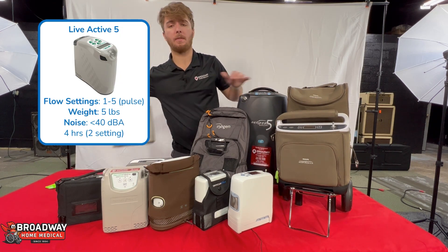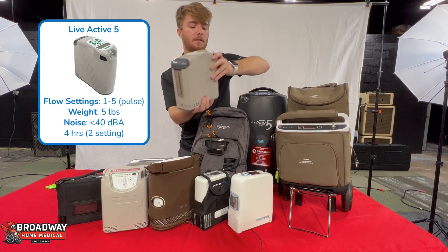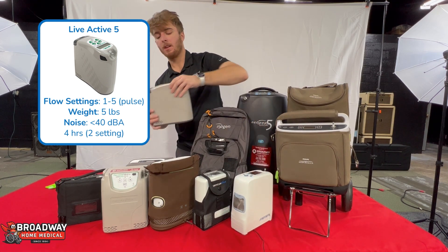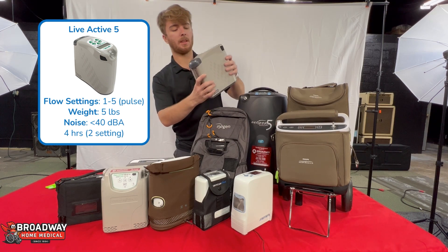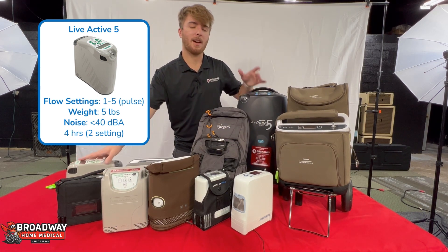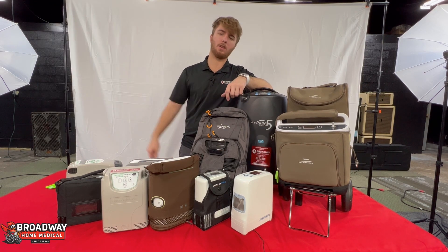Next up we have the Precision Medical lineup of POCs. This is the LiveActive 5 — kind of their competitor to the G5. It's a little bit bigger and a little bit louder, but what people really like about the Precision Medical machines is they all have these nice easy buttons on top to select your setting with. You don't have to worry about reading a tiny screen — you just press your button for your setting and you're good to go.